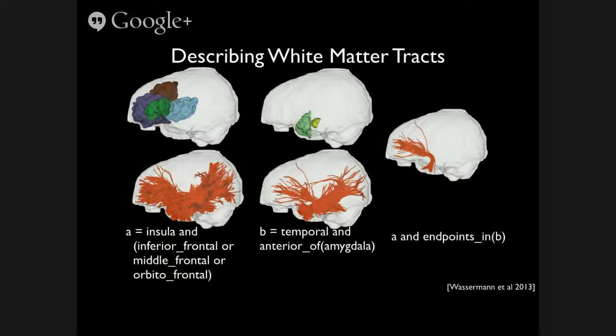The B0 is ACPC aligned, and once we have the T1 registered to the B0 using Sandy Wells's mutual information, we use that deformation to bring the parcellation in. We usually use ANTs, but it's independent. You just need that result.